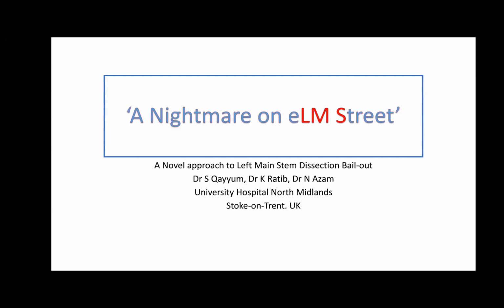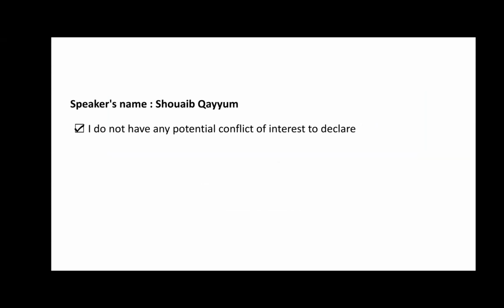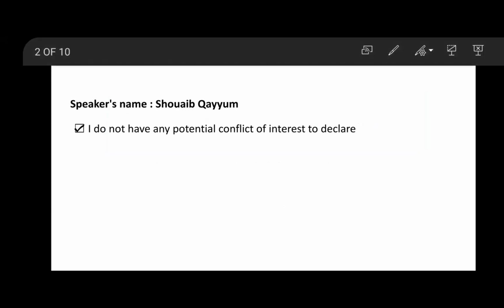Sorry to interject, another technically important thing I was having: for example, if you had Eagle Eye, that is a 20 megahertz probe, and it has deeper penetration compared to the 40 megahertz catheter I think you used. Yes. You end up with a snowstorm though, and you can't make out anything. I'm going to just let the speaker carry on, if that's okay. Yes, please do. Go ahead. Introduce yourself, please. Go back to your slide 1 and then carry on.